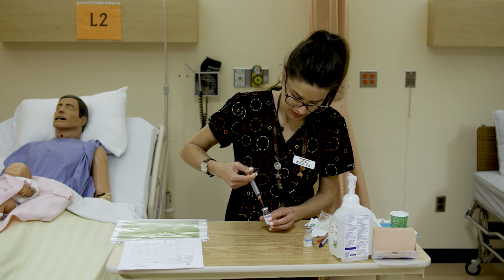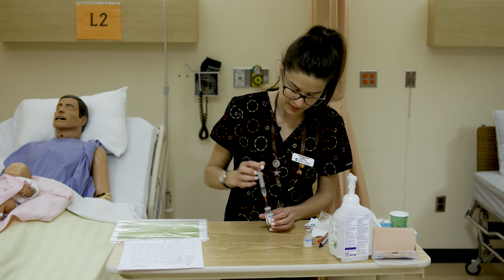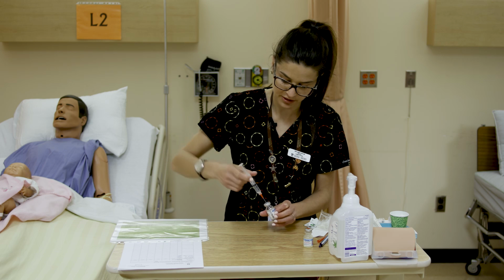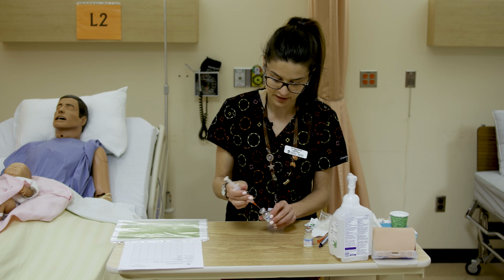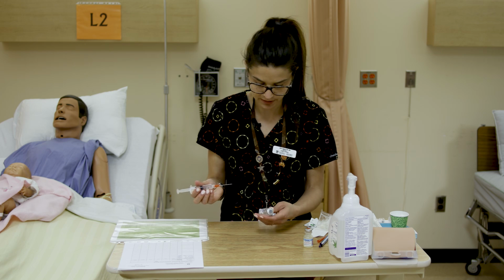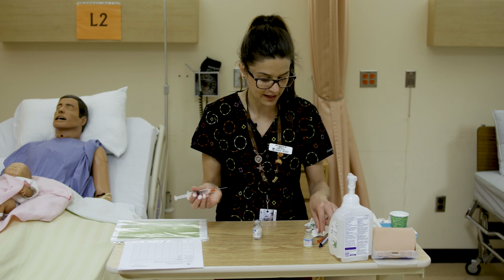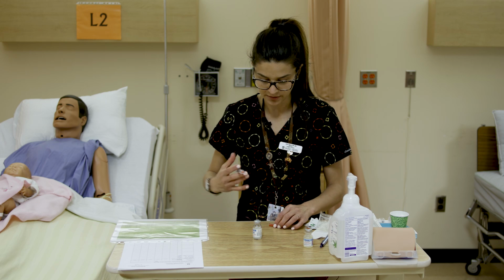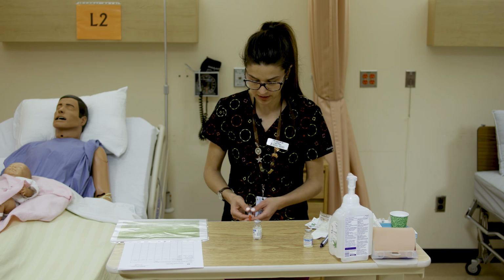And you're going to want to, some air will push out. You can help it along taking out some of that excess air so that when you remove your syringe from here, it doesn't do a spray back because of the pressure inside the vial. So that was good, it didn't spray back or anything. And then you are going to gently rotate that vial until the medication is mixed. Oh, we want to do our scoop method, right? So scoop and press.